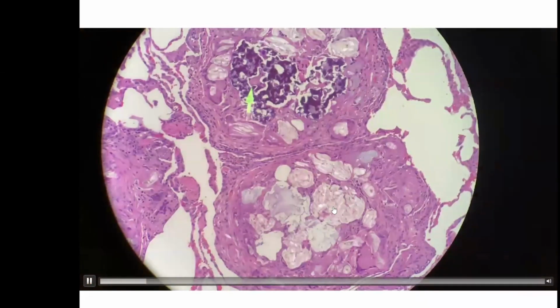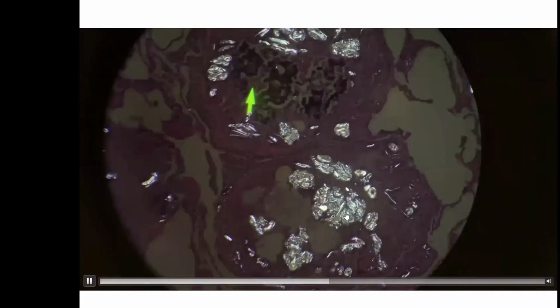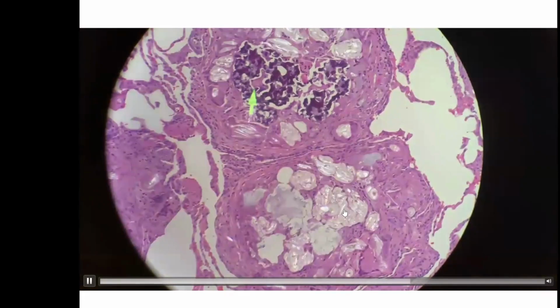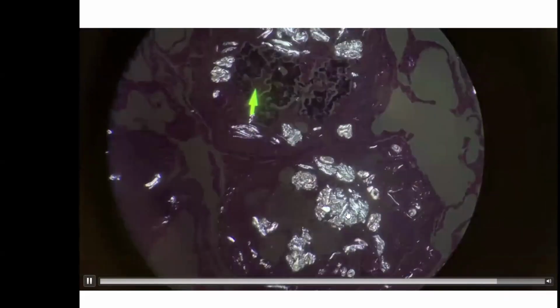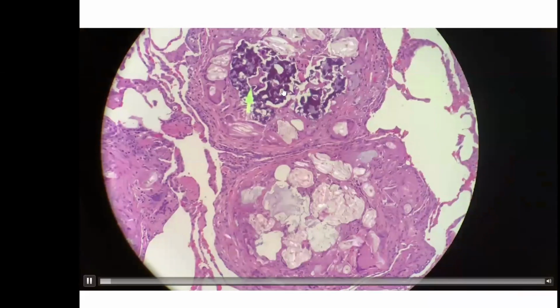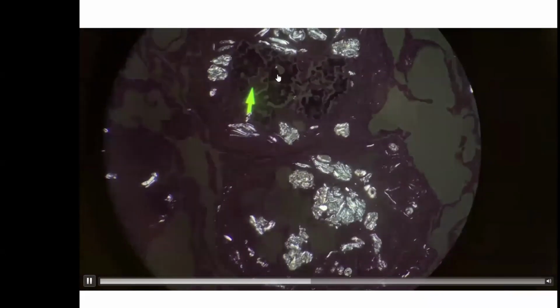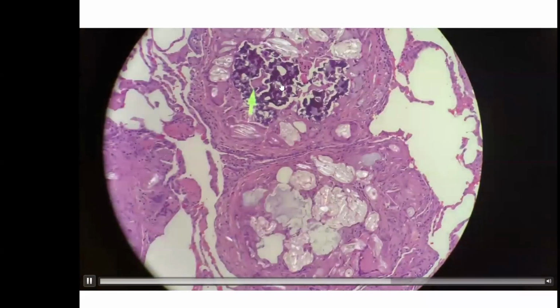And in this case, we actually see two different types of pill fillers. So this more colorless material that polarizes quite nicely is the microcrystalline cellulose, whereas this purple appearing material, that doesn't really polarize, is the crospovidone.